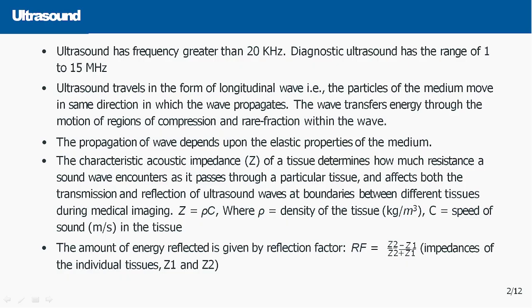The propagation of wave depends on the elastic property of the medium. Without a medium, this acoustic signal cannot travel, unlike electromagnetic waves. So in this case, as they follow the wave property, they require one medium for propagation that must have elastic property. Depending upon those elastic properties of the medium, this acoustic signal will face the acoustic impedances.